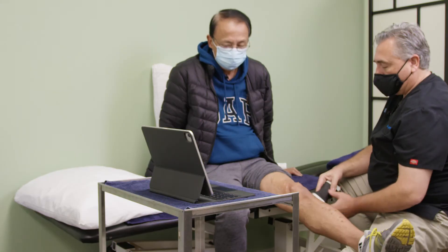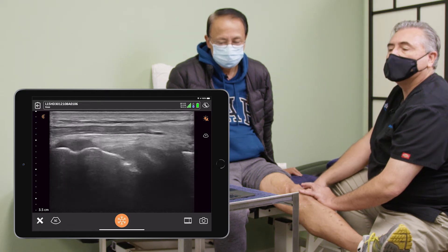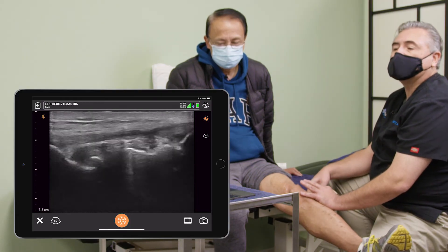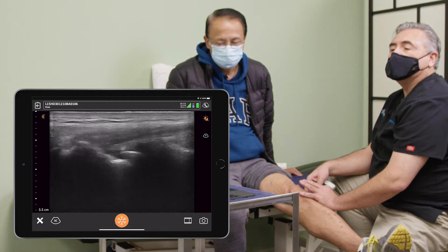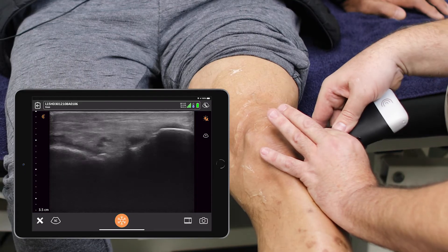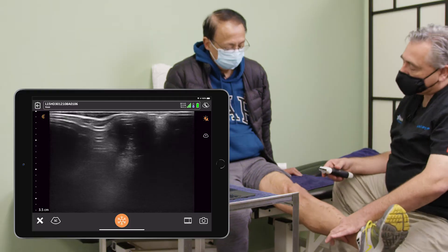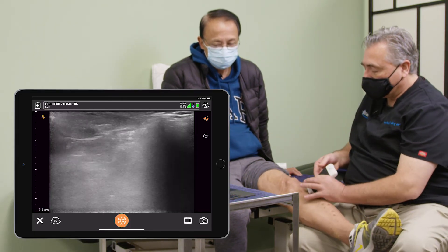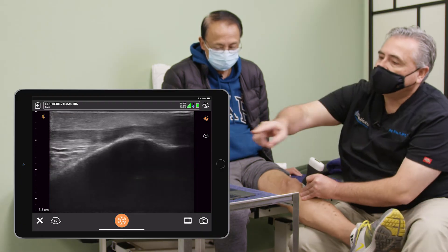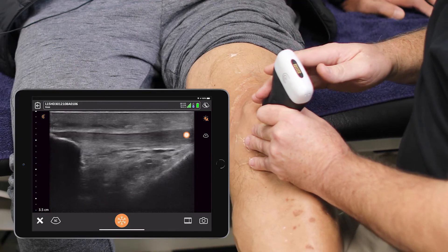I'm going to now go to the outside and come around here. We're going to go down and look at the joint line here — the lateral collateral ligament. I am seeing meniscal tissue here more than I was on the medial component. I am also seeing spurring, so this confirms osteoarthritis, but he does have a lateral meniscus that is far more viable than the medial one was. Now I want to look at the tendon — you can see the fibers of the tendon there. The bone is down here. This is the tendon they strike with the reflex hammer to check your reflexes at the doctor's office, and that all looks great.